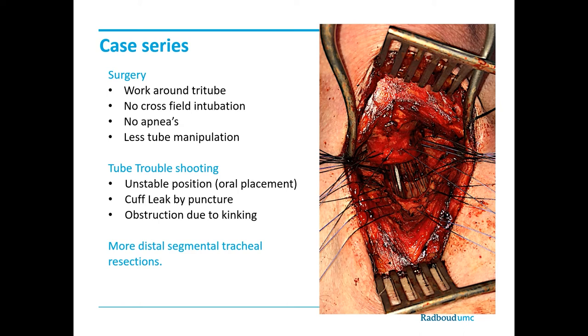We found out that nasal placement resulted in a more stable position of Tritube. Of course, with tracheal incision, there's always a danger that it will result in cuff leak. You can try and prevent it by emptying the cuff before tracheal incision, but it's not always totally preventable. We also saw some obstruction due to kinking of the tube, but nasal placement reduced that as well.